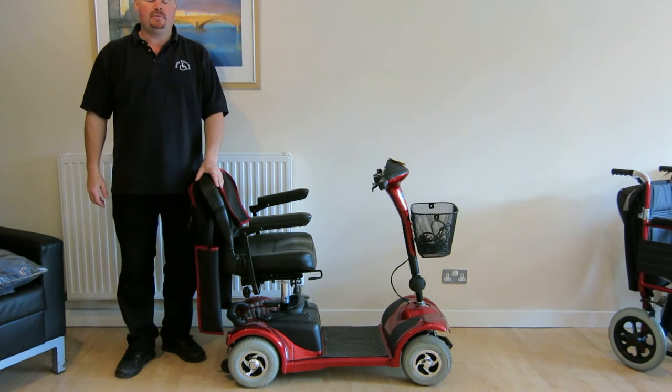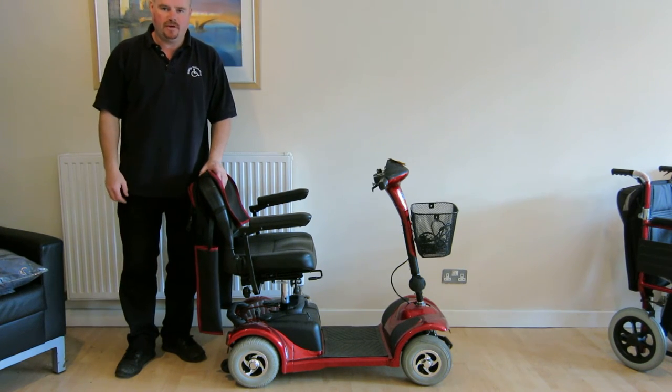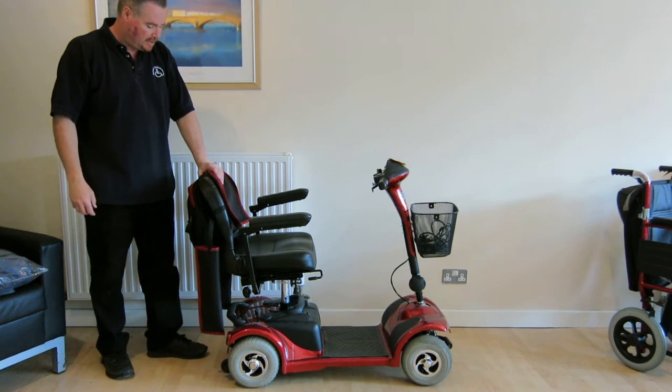Hi, this is just a quick video about the different accessory options that we offer for our range of mobility scooters. This is the Explorer 4 mobility scooter.